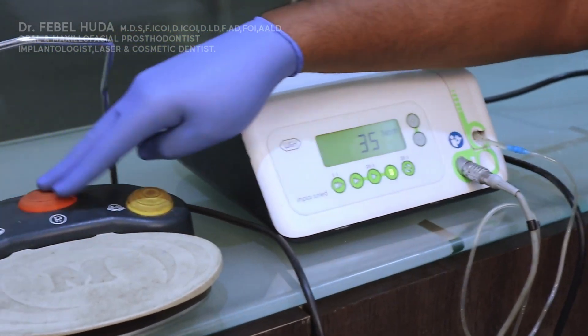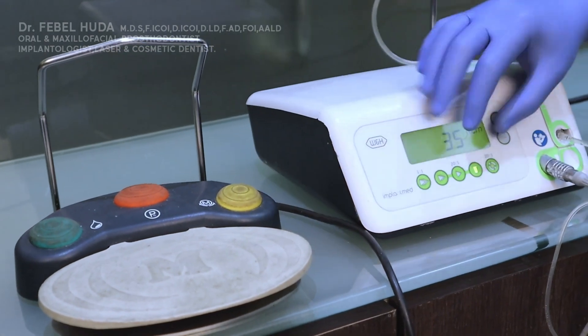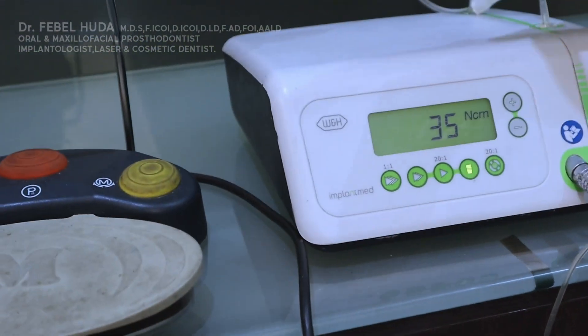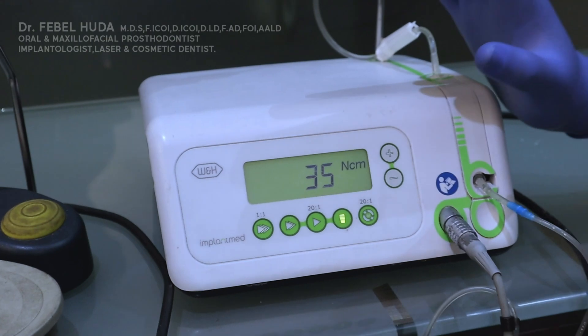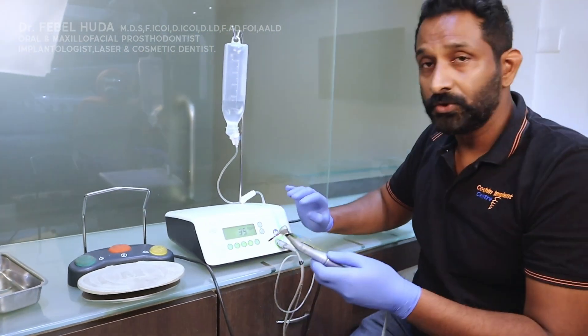To summarize: the stand has three buttons — one controls saline, one controls the program, and one controls forward and reverse movement. There are two main modes: one for osteotomy drilling and one for implant placement into bone. These are the basic controls of the physio dispenser.